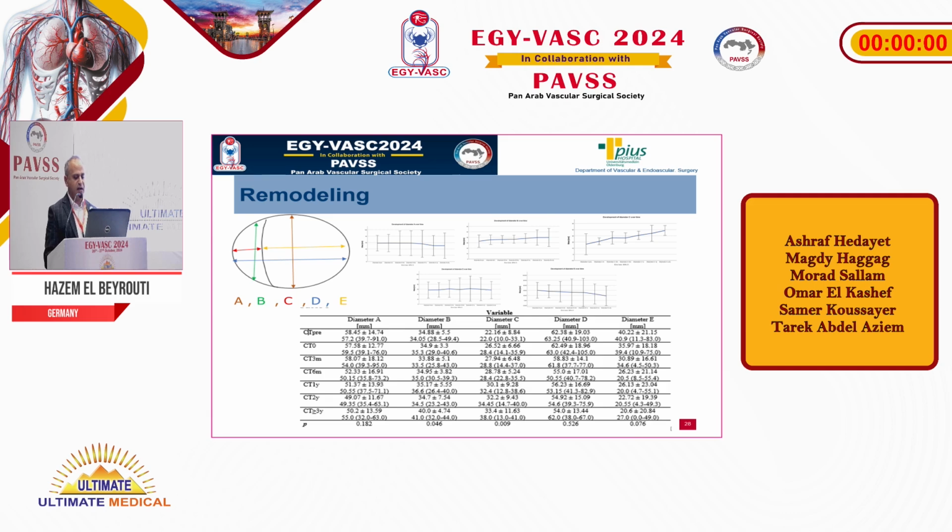Here, after 3 years, we can observe good remodeling with a significant expansion of the true lumen, as you can see here, and shrinkage of the false lumen.